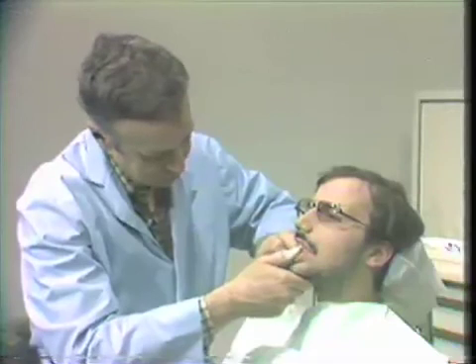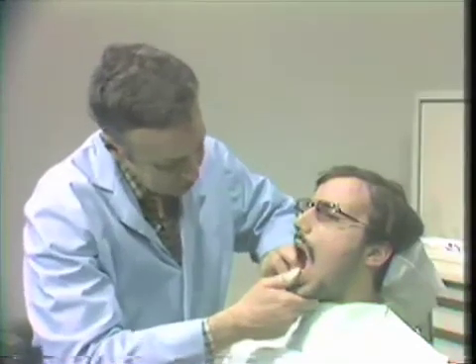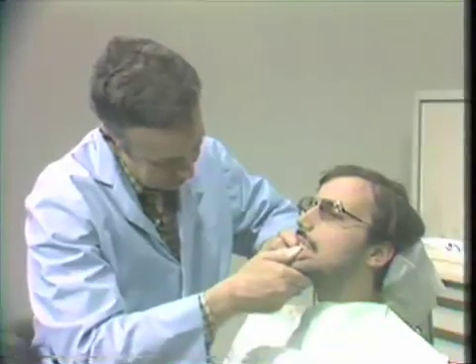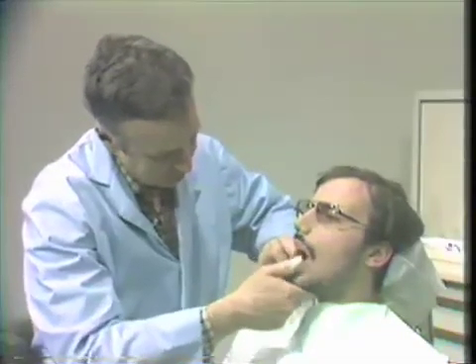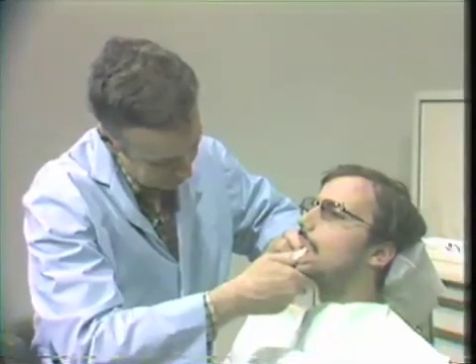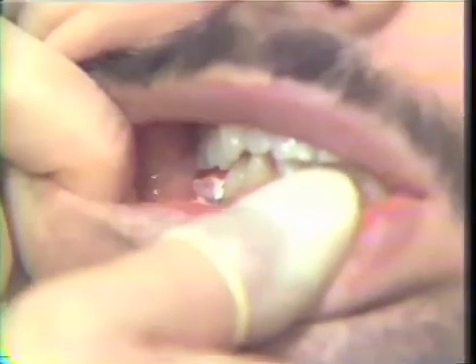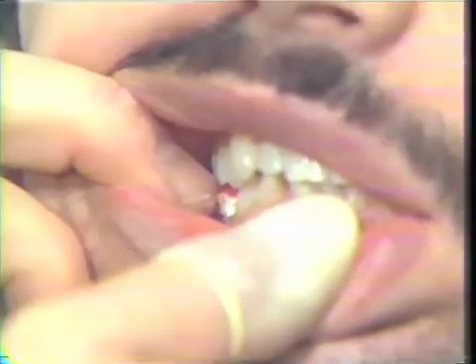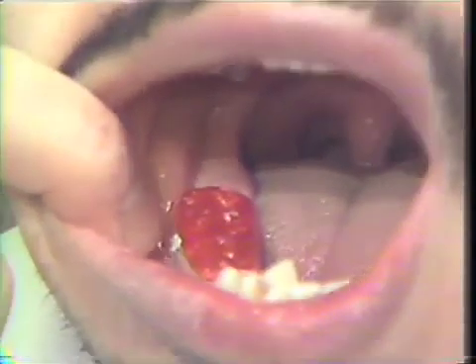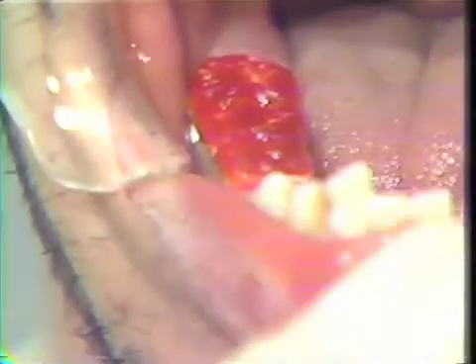Open please, fine. And we'll just allow that to set up just another moment, and back together again please, that's fine, good. Open again. We're going to manipulate the patient back into centric relation first. Just come together, squeeze together, good. Allow him to slide up into centric relation, a centric occlusion. Open again please. And we have now registered our centric areas in the wax, and now we will go through our border movements. Back together please.